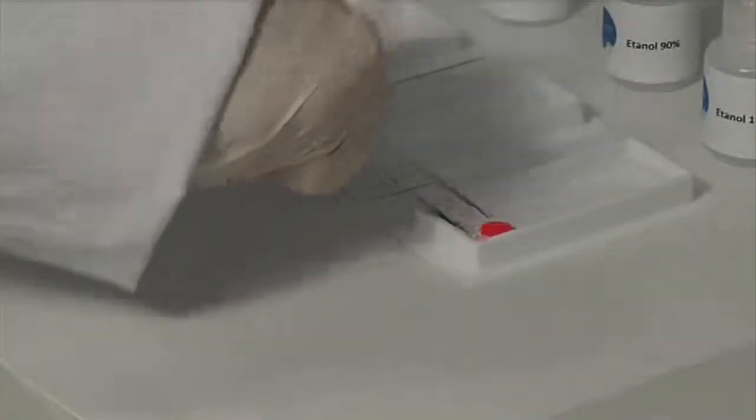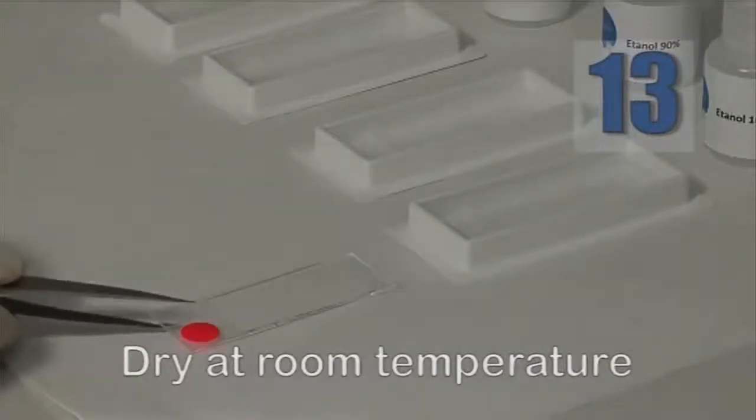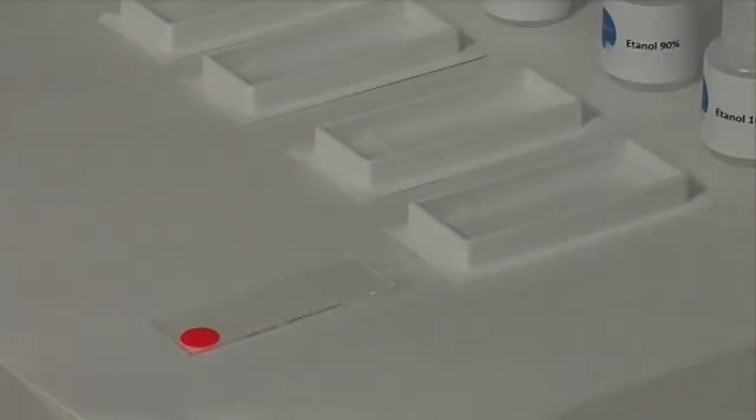Leave the slide to dry at room temperature. Once fixed, the slides can be stored indefinitely and stained at a later stage.